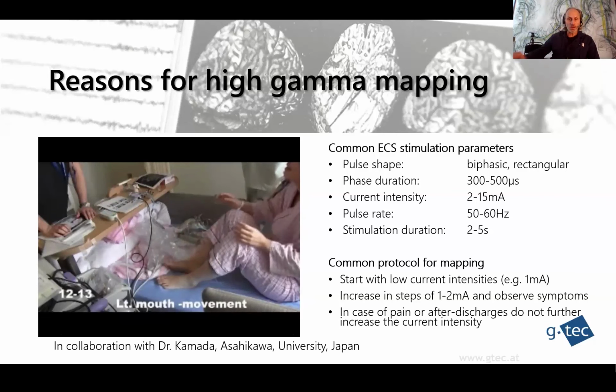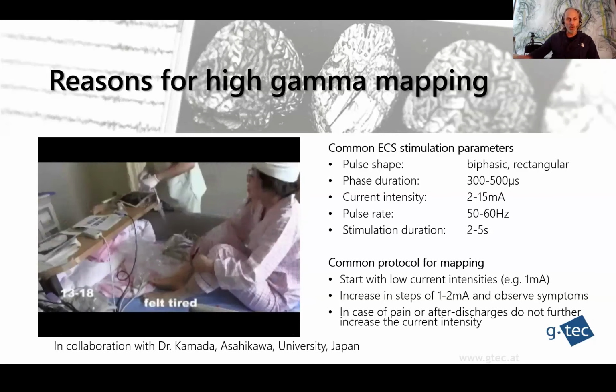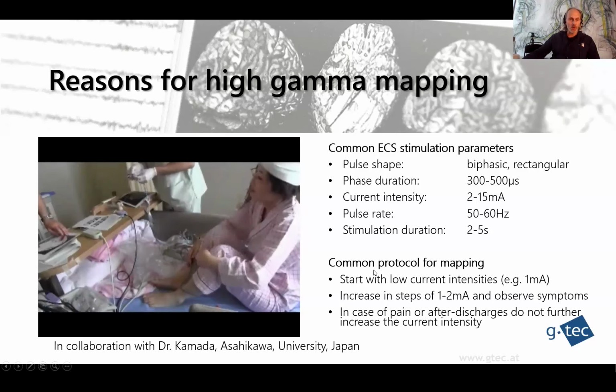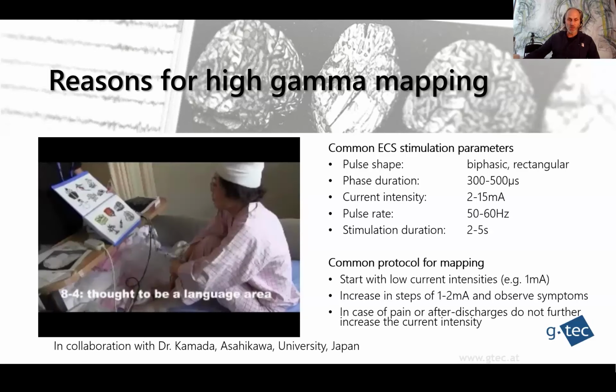See, she's indicating lips here. Now he writes down 12, 13 lip region. In this case, Sanadi is connecting the stimulation plugs to the electrical stimulator. So this is done at this time manually.